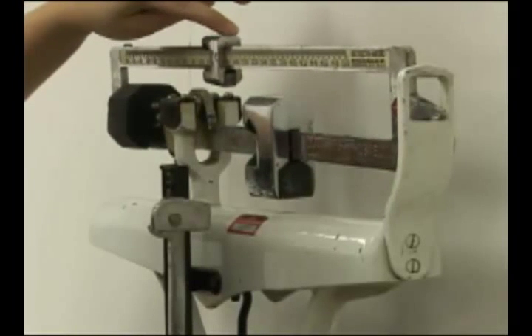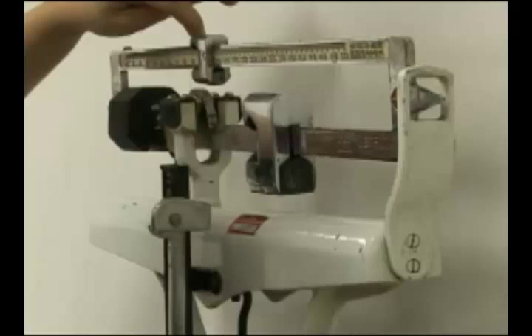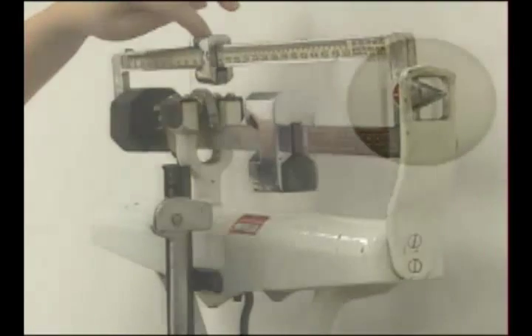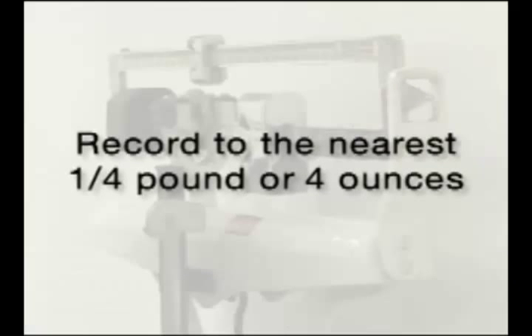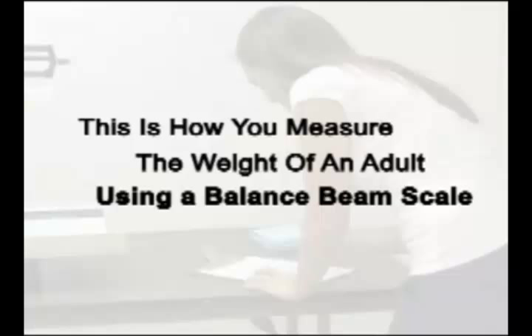You can then move the upper weight to the right until the indicator arm balances in the center. Record the measurement to the nearest quarter pound or four ounces. That's how you measure the weight of an adult using a balance beam scale.